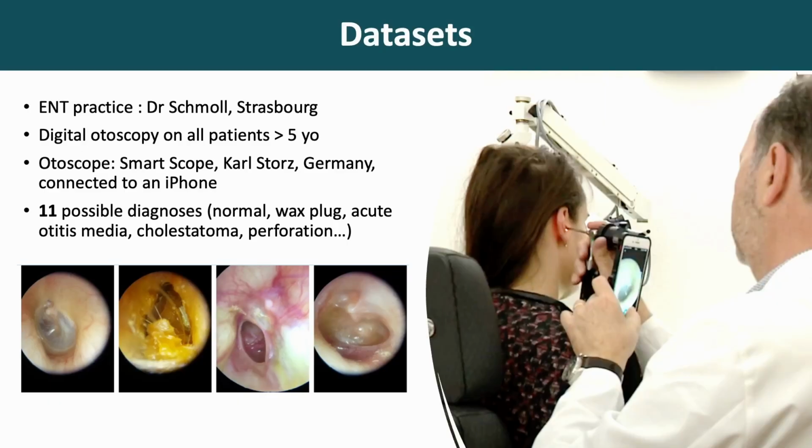The project started when we met this ENT specialist, Dr. Schmoll in Strasbourg, and in fact he had been doing digital otoscopy for many years in his office already, in all patients, mainly patients above 5 years. He was using an otoscope from Karl Storz, a German provider. As you can see in this image, this is Laurent Schmoll doing digital otoscopy. He has this otoscope connected to his iPhone, and he's taking pictures of what he's seeing inside the ear.